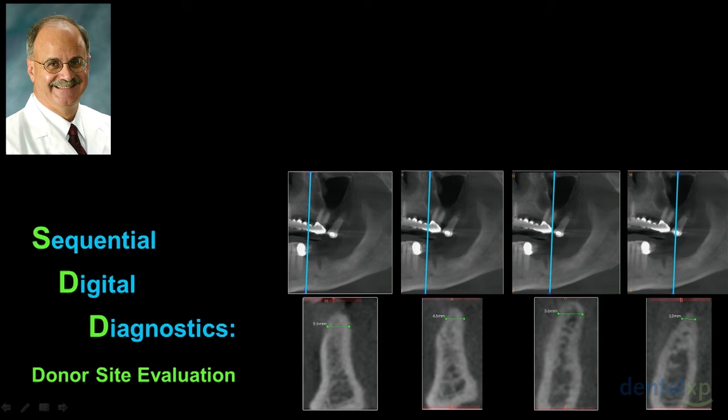A number of maxillary molar lesions, in fact 32%, by Lowe, has been shown in the endo literature, 32% of all periapical maxillary molar lesions go undiagnosed with a PA radiograph. So for those of us thinking that that's still the gold standard to evaluate maxillary molar and bicuspid pathology, wrong. 1/3 of those lesions are undiagnosed. You won't miss them on a CT scan.